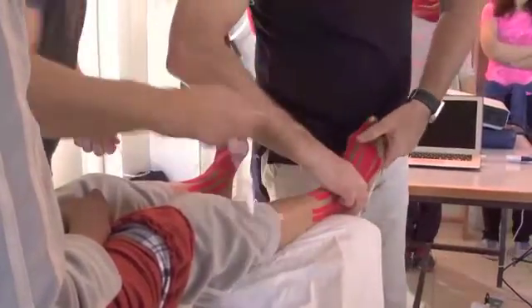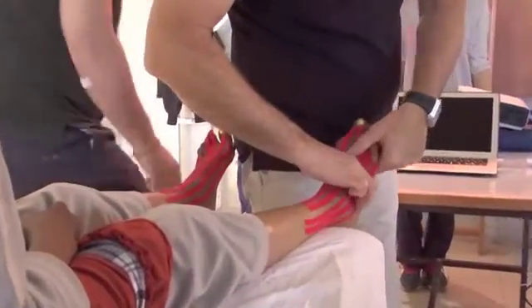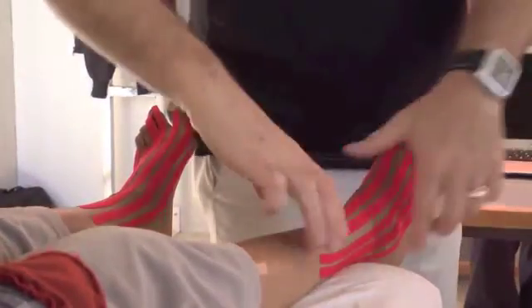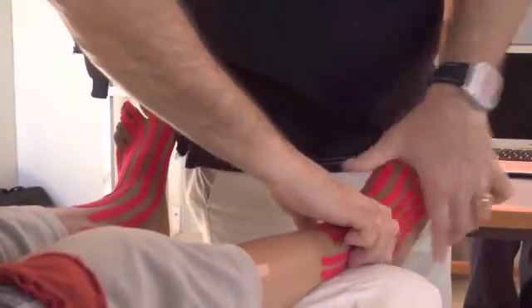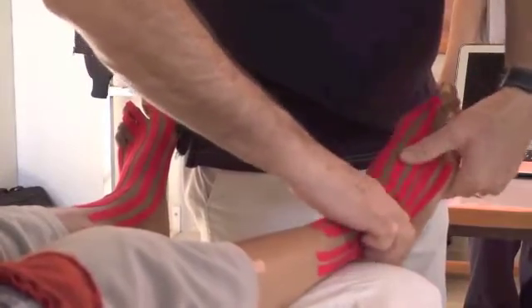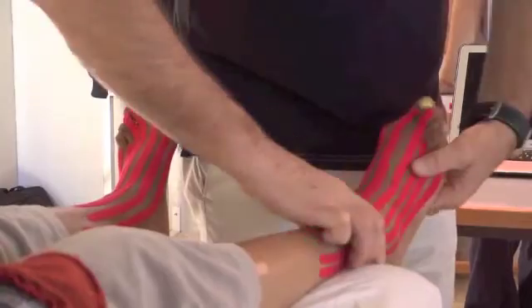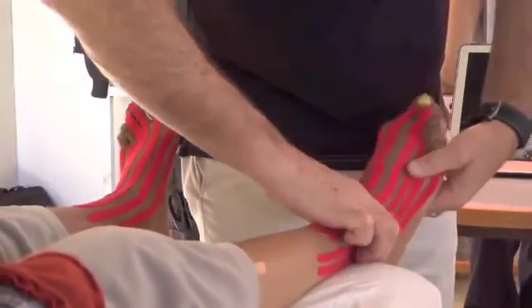We need to activate the tape in this way. So with your two hands you are moving the tape towards the center in this way. And then together with the movement — the joint movement — together with pushing the skin towards the center in this way.